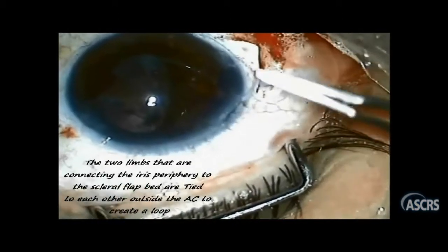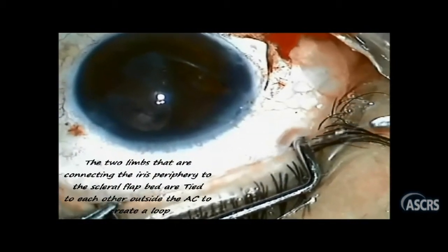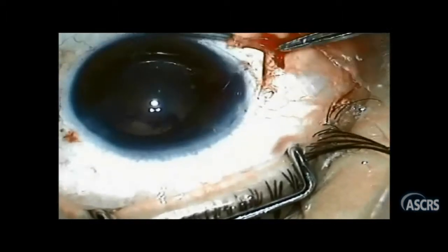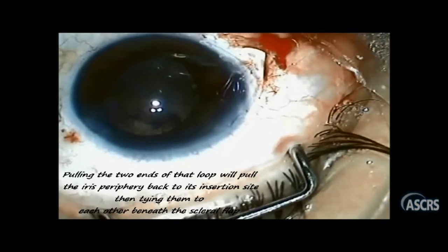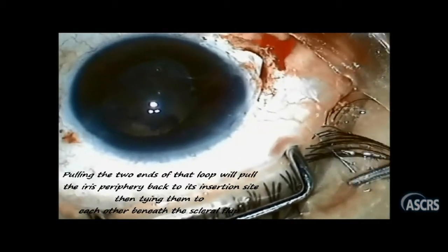The two inner ends are tied together forming a loop, and finally the two outer ends are pulled to approximate the iris to its root, and tied to each other below the scleral flap.